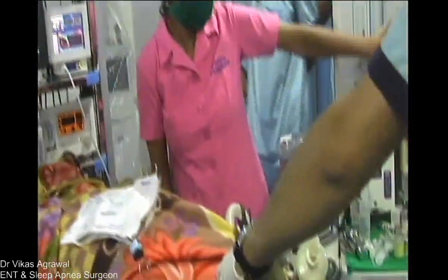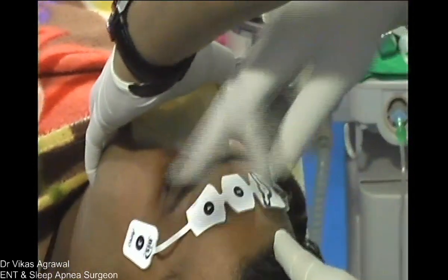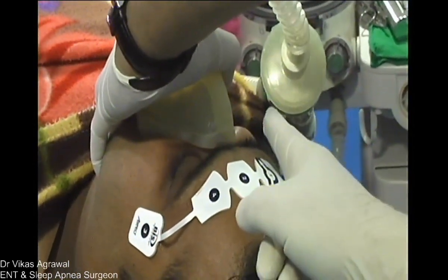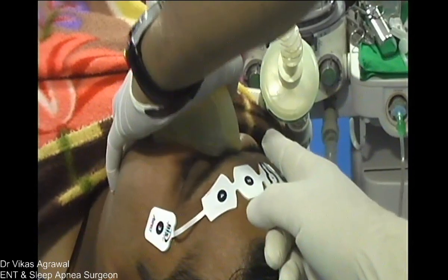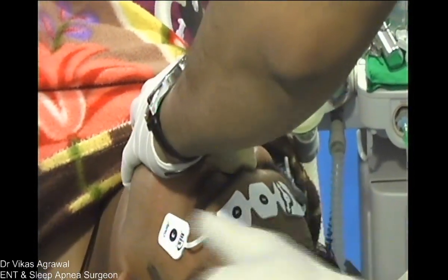Now, as you can see, Dr. Kalpesh is inducing the patient. He has put this BIS strip onto the head of the patient. And as we predicted earlier, he will be able to ventilate the patient very easily. So even without much struggle, he is able to ventilate. And now you show the monitors.